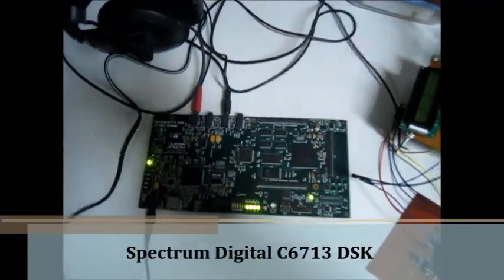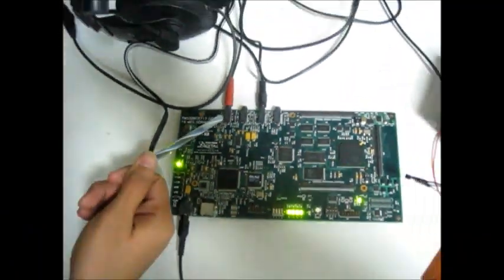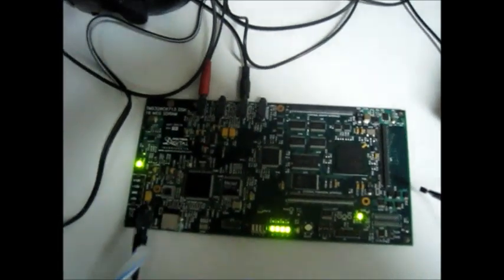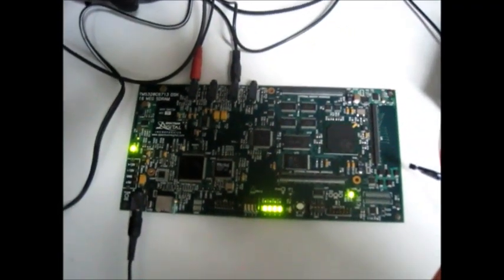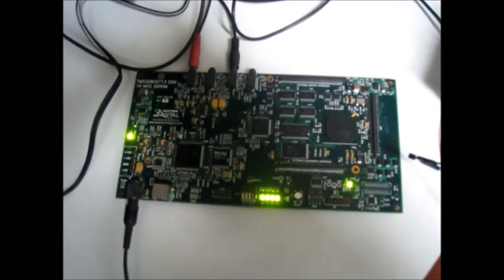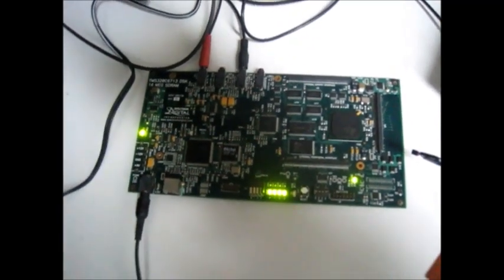We have used the C6713 digital signal processing kit provided by Texas Instruments and manufactured by Spectrum Digital. The microphone input is given to the mic in port of the C6713 DSK. We have used an isolated word small dictionary consisting of control commands left, right, back and forward to maneuver the wheelchair. The voice recognition algorithm used is the Mel frequency cepstral coefficient algorithm.